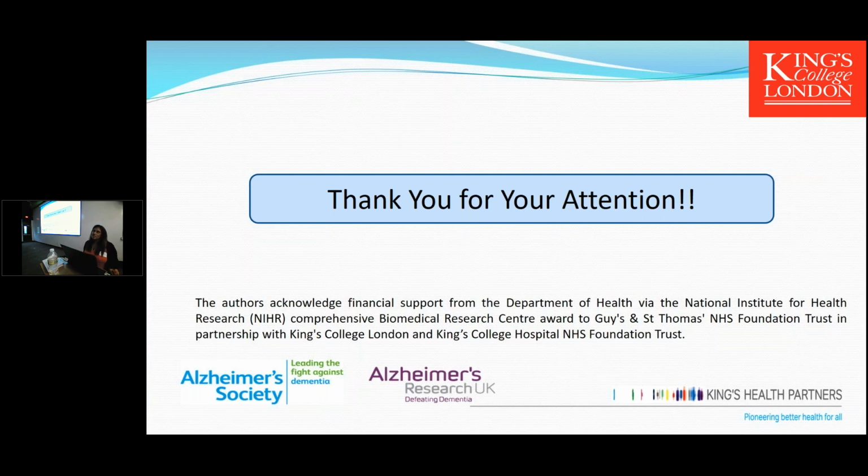But I think his interest might be using, instead of copper-64, some of the PET agents that we use in human patients to label amyloid plaques. So you have the F18 florbetapir, florbetaben, or flutemetamol. We're a little bit dependent on when a clinical trial is happening on a patient and our PET center is making that particular compound. Then we would use that to evaluate the amyloid plaque load first, and then look at chelating effects by stripping down. Yeah, see what happens.